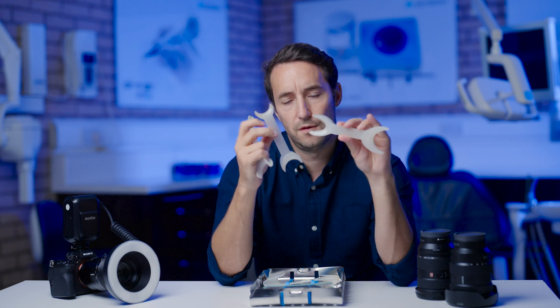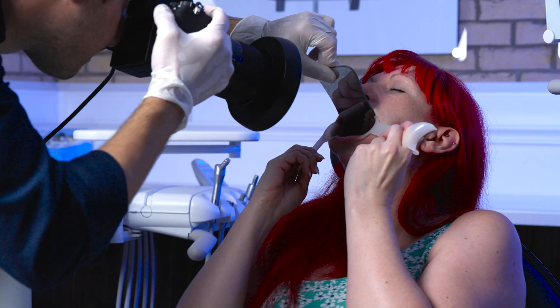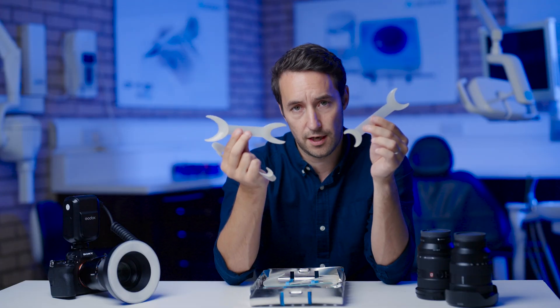If you're doing mirror views, you would use the small side of these retractors just because it makes them less obtrusive, and you can actually get better retraction by pulling the lips away using these two than you would with one that has more horizontal retraction.